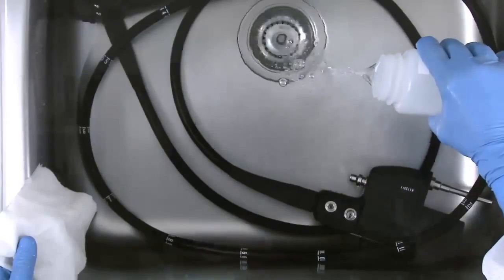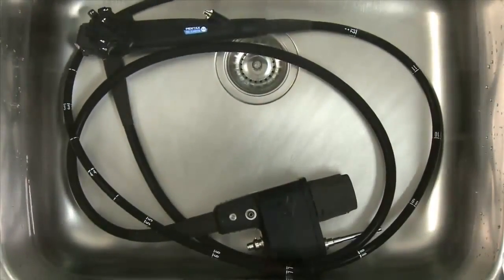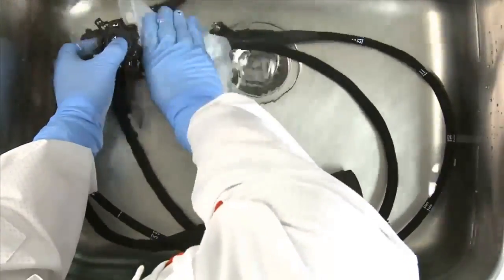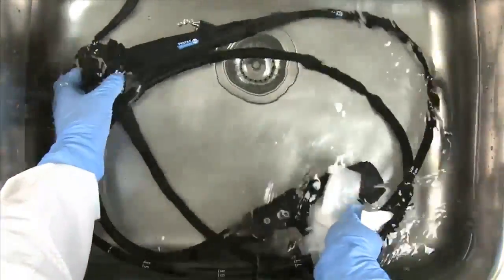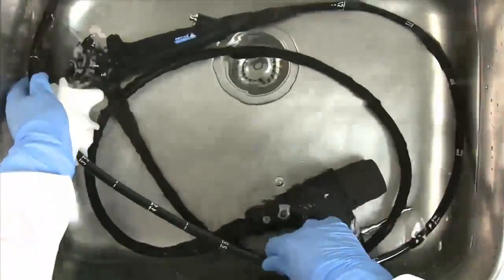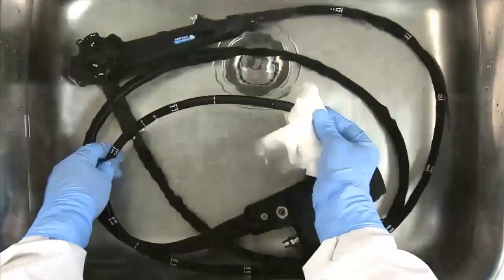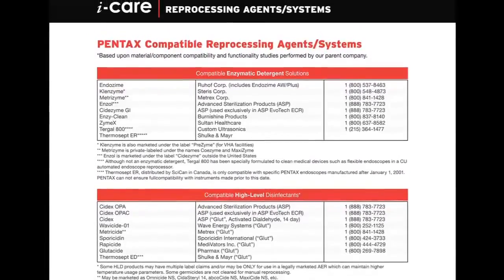Add enzymatic detergent solution and allow the endoscope and its components to soak in accordance with the detergent manufacturer's recommendations. While soaking, wipe the endoscope with a lint-free cloth from the control body to the distal end and down the umbilical to the PVE connector. Do not pull the flexible insertion tube or umbilical through your hands. To know which appropriate enzymatic solution to use, always refer to the PENTAX Compatible Reprocessing Systems Agent document.